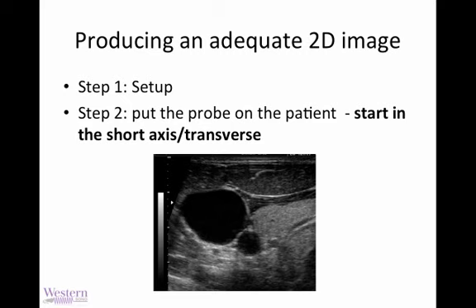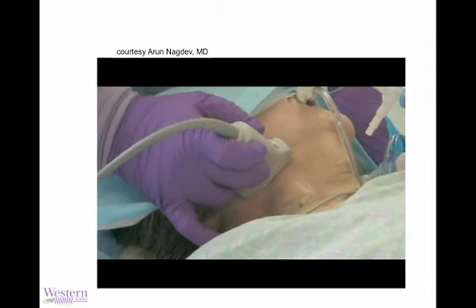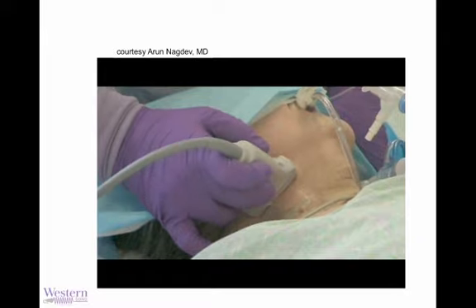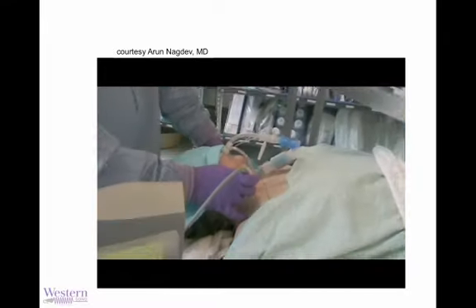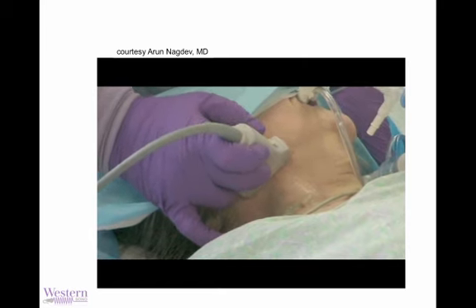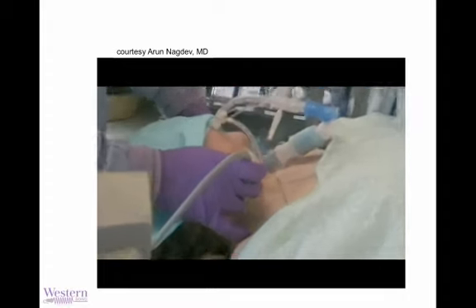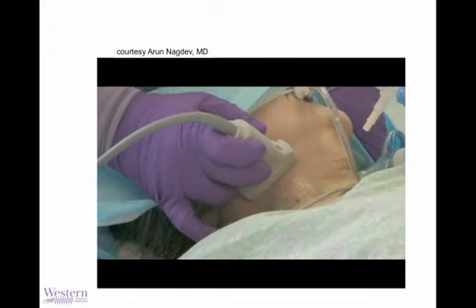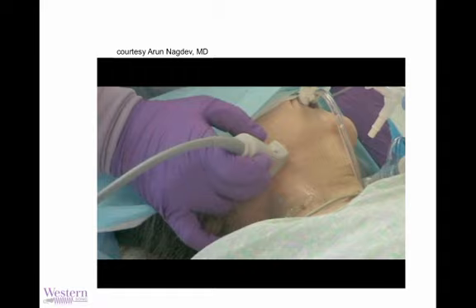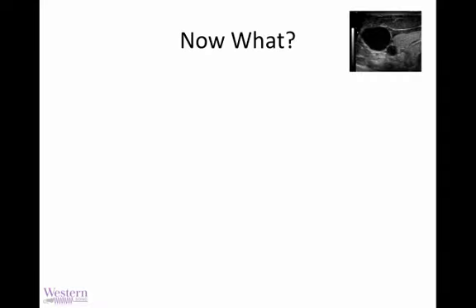And to do this, I suggest pre-screening patients rapidly before you get sterile in the short axis technique in a fashion such as this. You can see this operator has non-sterile gloves on and is just simply having a quick look on this patient's right neck to see, is the IJ suitable? Is it located in a favorable location? Is it a good size? Does it have a clot or thrombus in it? And having a good look around, because before you get sterile, you might like to make sure of this so you don't get caught switching to another site or another side.